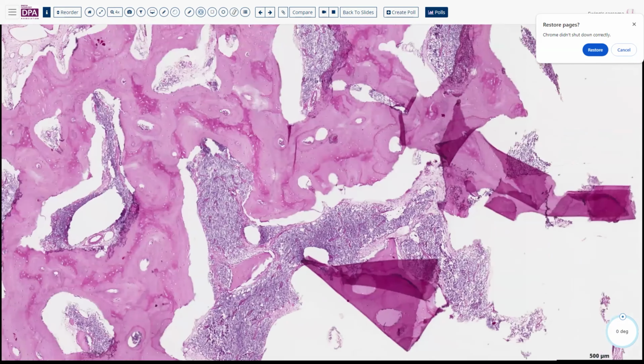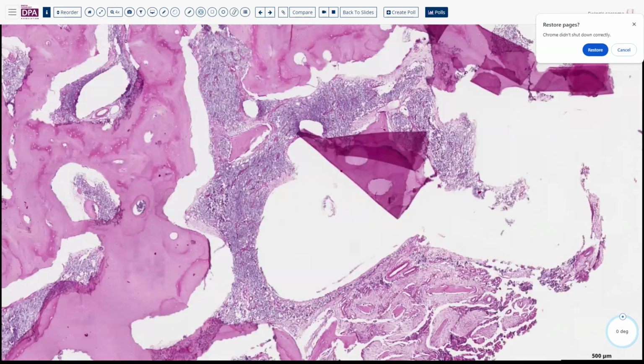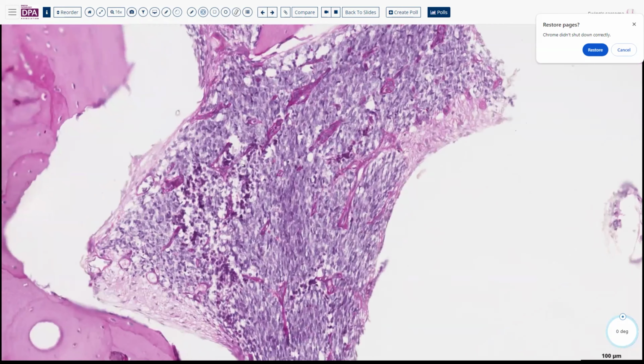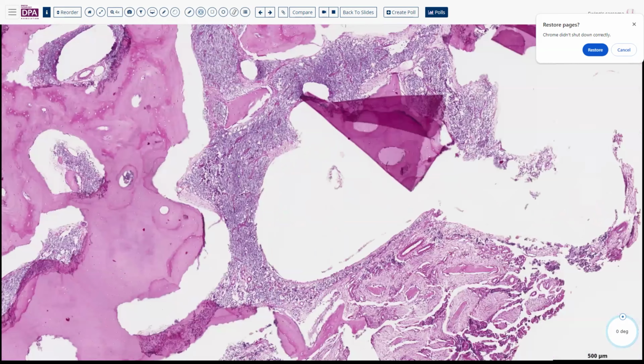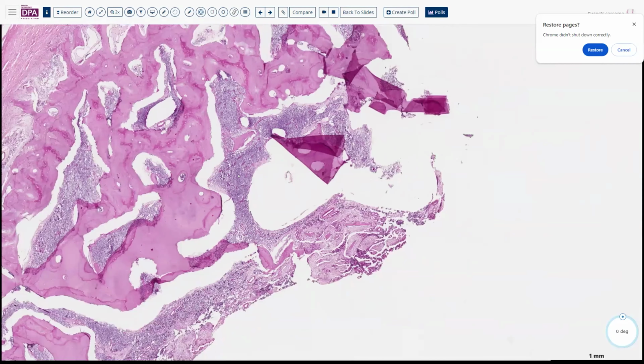So those are the teaching points from this: the pattern of growth, the elevation of the periosteum, the interesting use of PAS stain, the cytomorphology of this tumor, and then, of course, the wonderful improvements in outcome with the advent of new therapies.